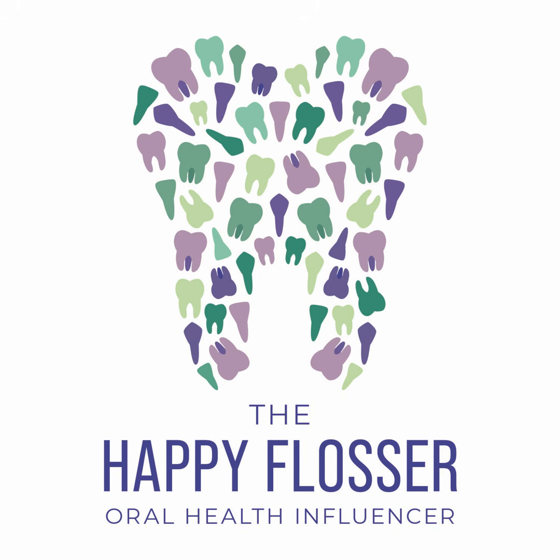We tend to get a little hyper focused on the horizontal bone architecture and the vertical bone architecture. And I know in school, when you're learning about radiographic interpretation, we have you doing all the things. You're looking at the horizontal bone, the vertical bone. You're looking at the interdental space. You're looking at the trabecular bone. What does everything look like? You're looking for all of the landmarks.